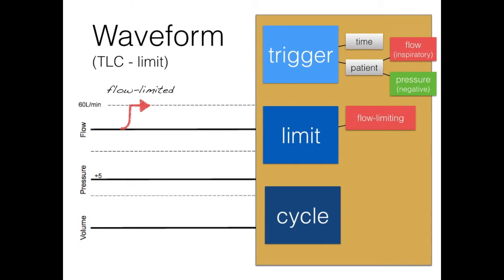Naturally, as the flow of gas is entering the lungs, the pressure and volume in the lungs is also increasing. However, notice that the airway pressure will rise to whatever level is required to deliver the selected flow. So, the longer the flow continues for, the higher the airway pressure and volume inside the lungs will be, which of course increases the likelihood of barotrauma to occur. Limiting the inspiratory time might help with this, and will be discussed at a later time. The flow limiting pattern has also been described as a square or constant waveform.